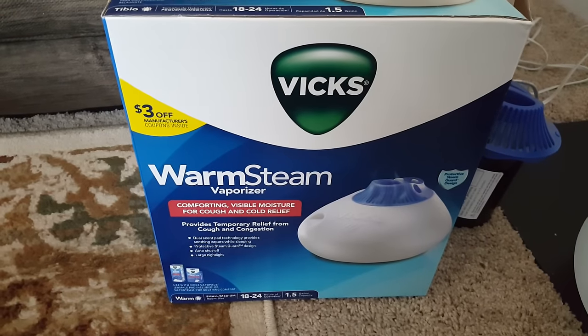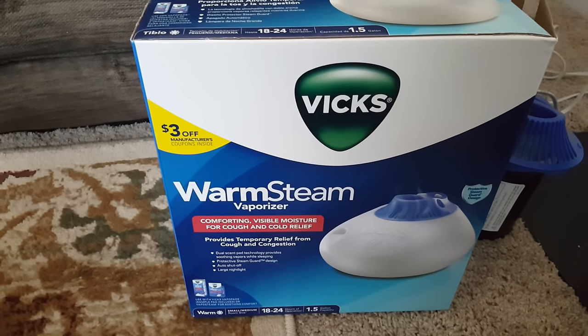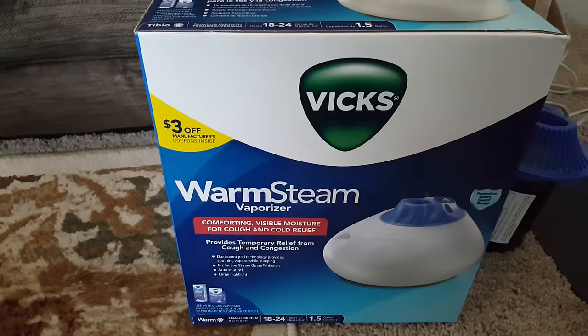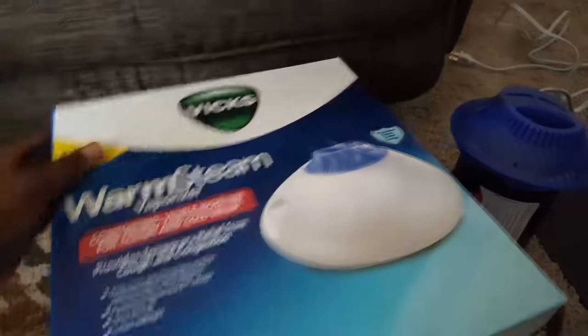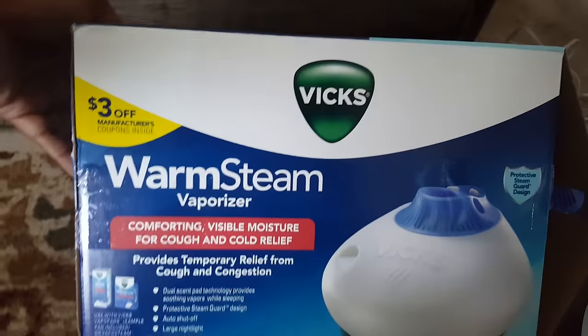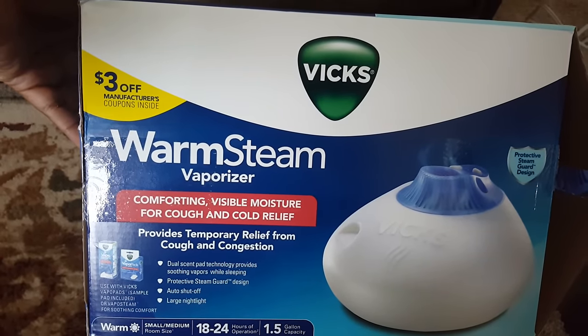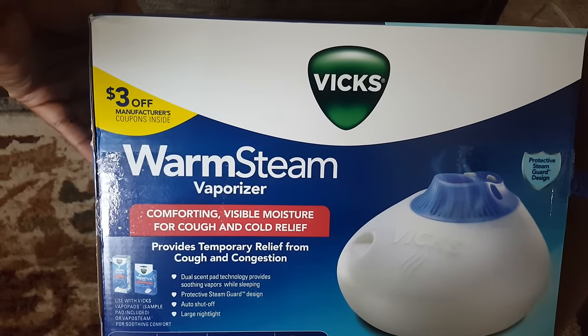Today I want to use my Vicks warm steam vaporizer, and I was thinking why not show you how I use it. This is how the box looks like — it's going to provide temporary relief from cough and congestion.